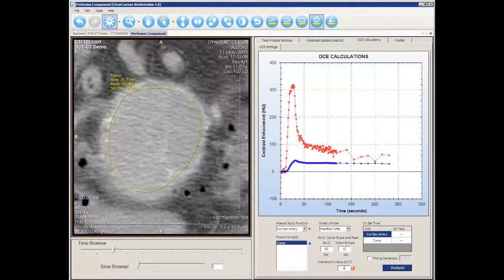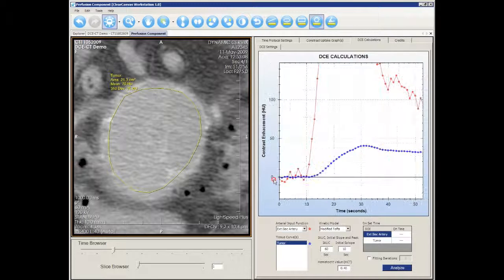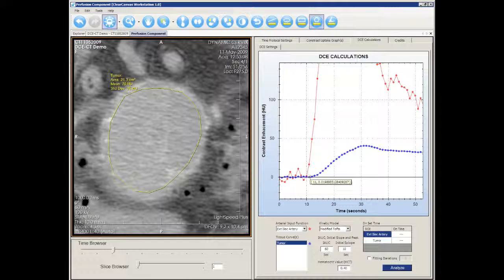We can determine the onset time of contrast uptake by zooming into the graph. It is 10 seconds for the artery and 11 seconds for the tumor. We can enter these values into the onset time box.